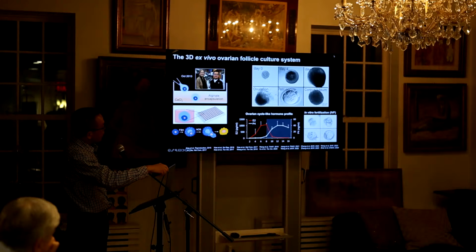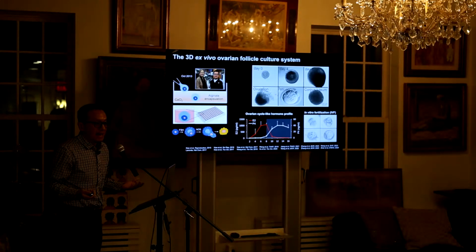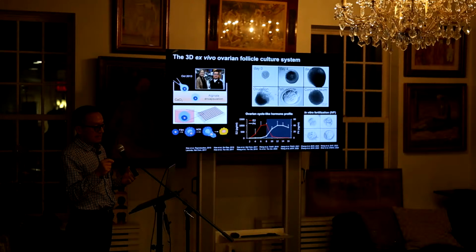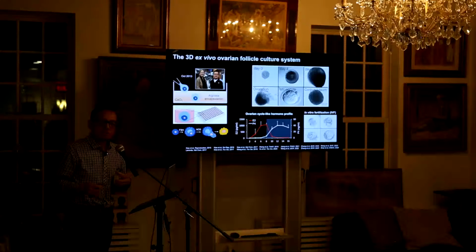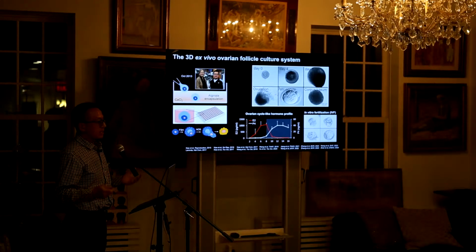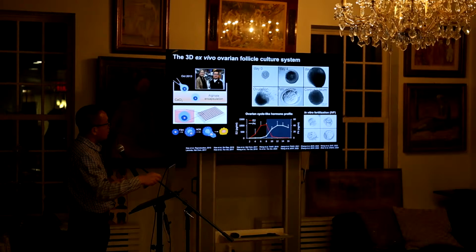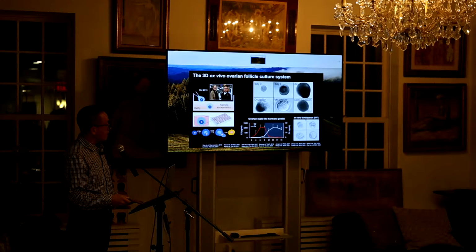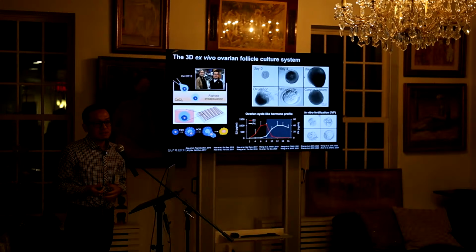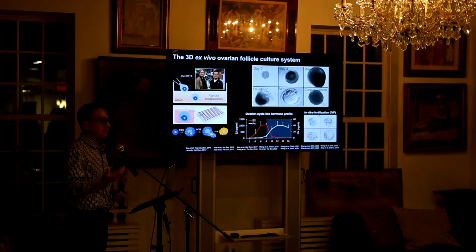And for the ovulated oocyte, you can also perform IVF. Because what we found is that when you culture follicles, the zona pellucida becomes pretty hard. So if you do traditional IVF, the rate is pretty low. But if you do ICSI, inject the sperm, they can become 2-cell, 4-cell, until the morula stage. And then if you transfer this embryo, you can make the pseudo-pregnant mice pregnant and deliver live pups.